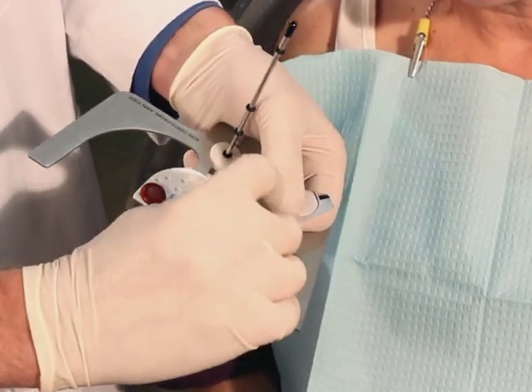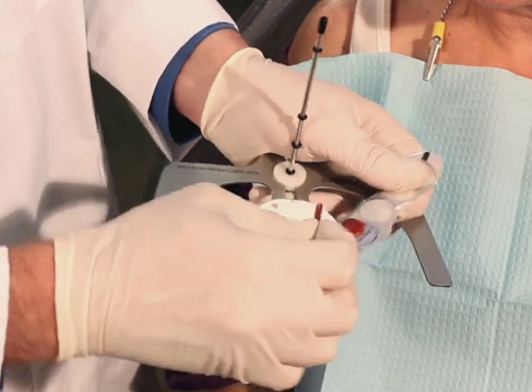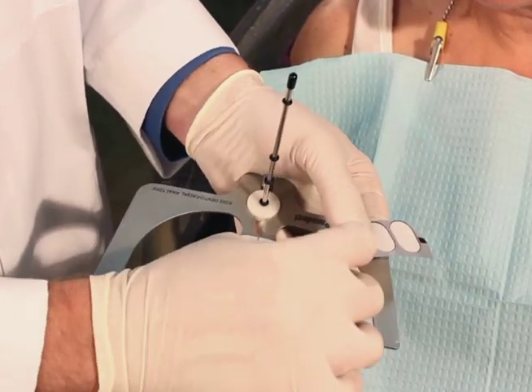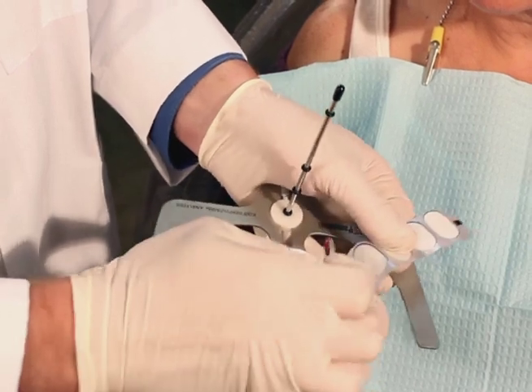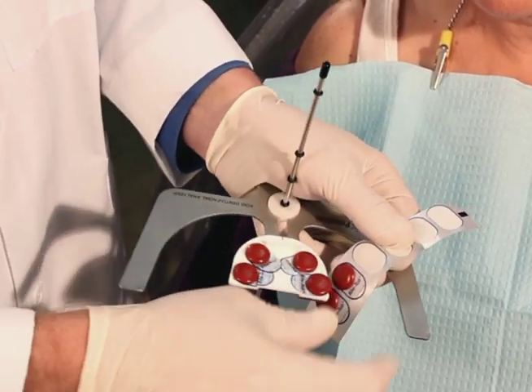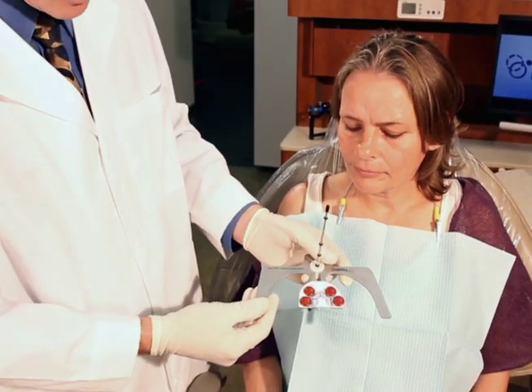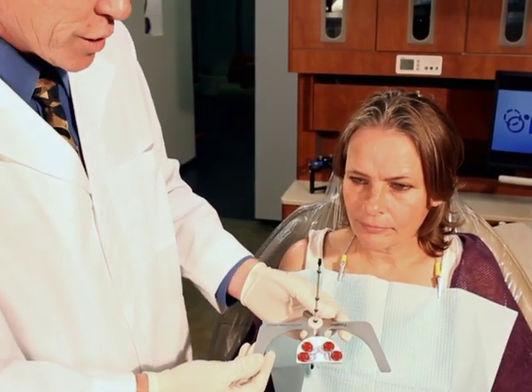We're also going to put two tabs over the bicuspid areas. Now that we have the bite tabs onto the Coyce Index Tray, we can temper this in hot tap water in preparation for the registration.